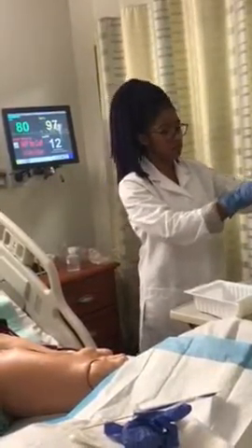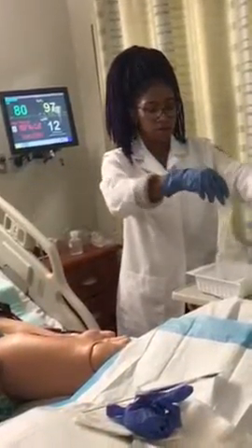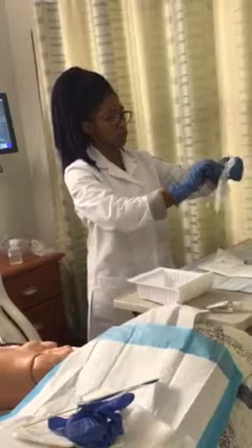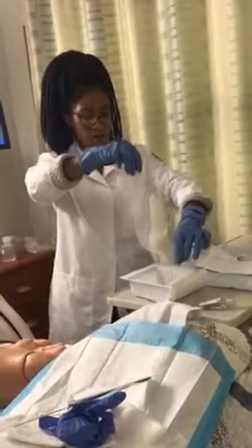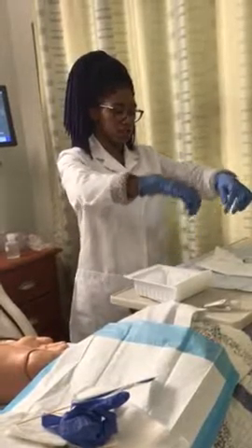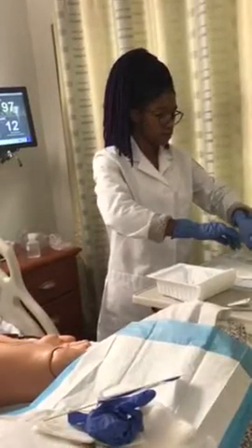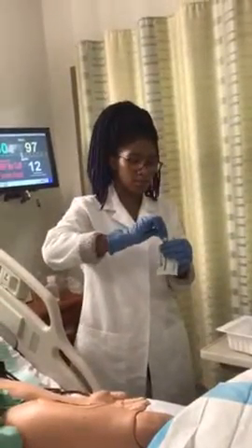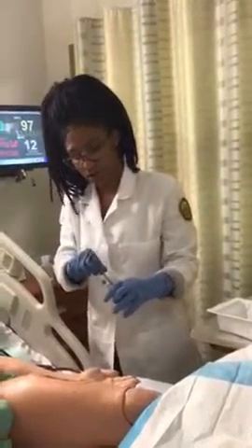Taking 2 4x4s, spreading them all the way out, putting them in the sterile saline solution to soak, making it easier for me once I'm ready to pack the wound. Making sure not to let my hand touch the water because then I would no longer be sterile. Once I'm ready, I can grab my sterile swabs and start to clean my wound.